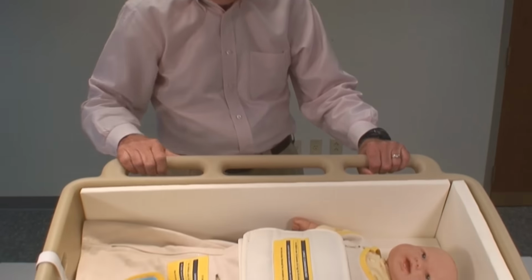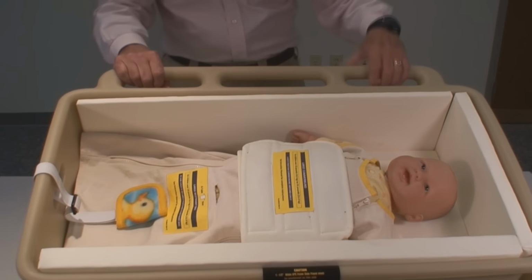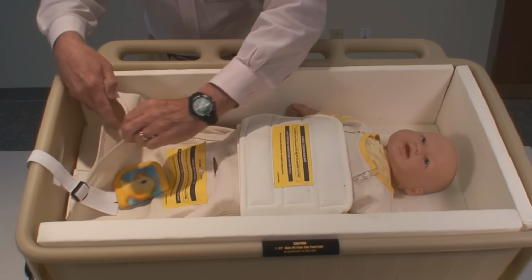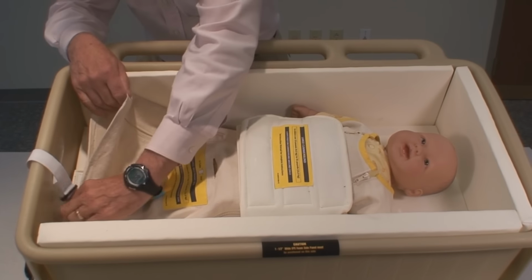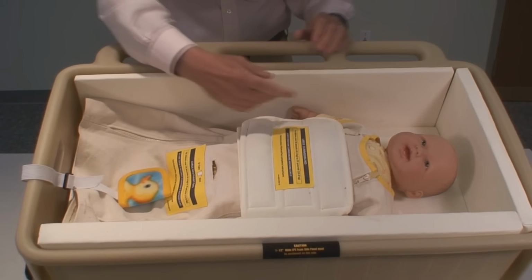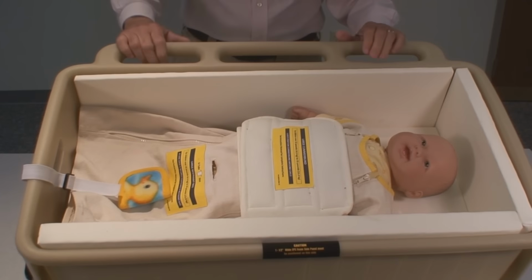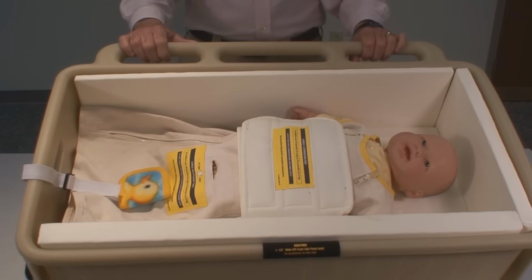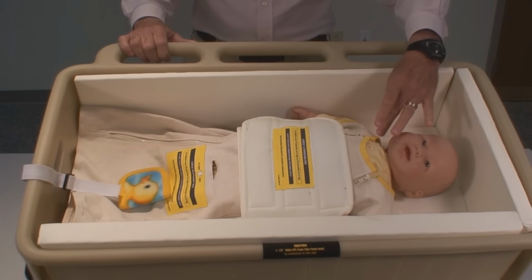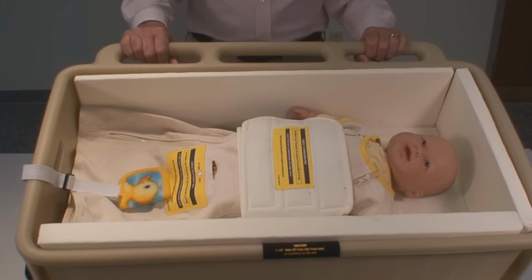The sleeping bag has a couple of features. It has a slot in the lower part of the bag for the G-tube. Then it also has openings in the bottom of the bag that you can insert the monitor leads through, and those leads would go up and hook to the child. Also, the restraint bag is designed to give easy access for the vent tube.